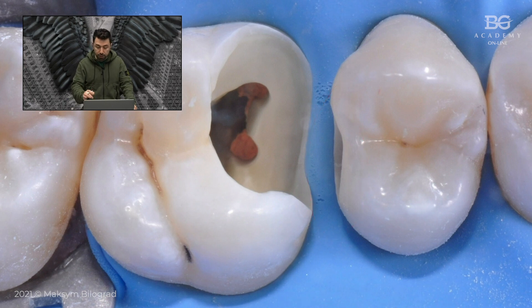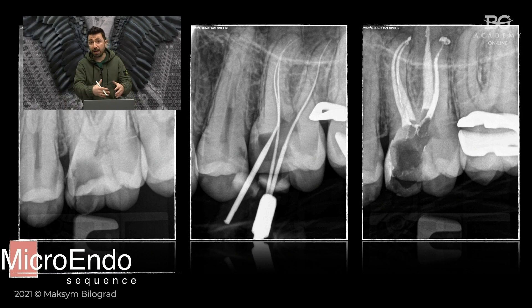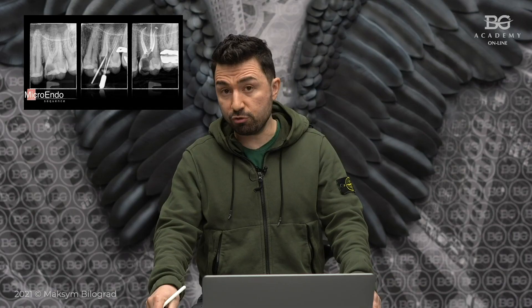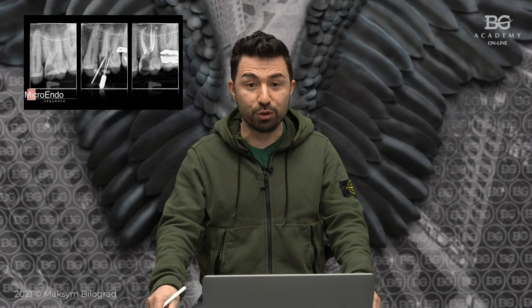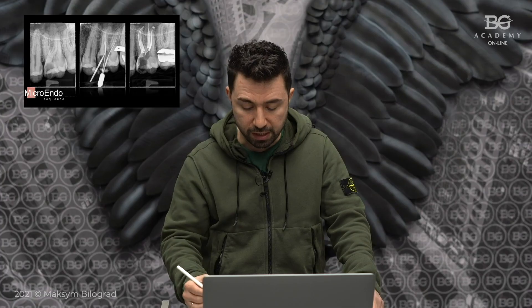The endodontic treatment was completed successfully because I was able to find all root canals despite the minimally invasive access. I was able to instrument all root canals, I was able not to break my files during instrumentation, and I was able to obturate — but the problem is that I made over-instrumentation in the coronal part of the root canals.